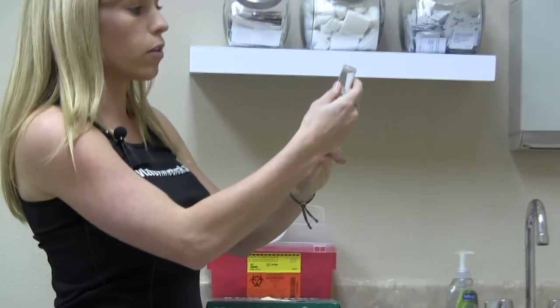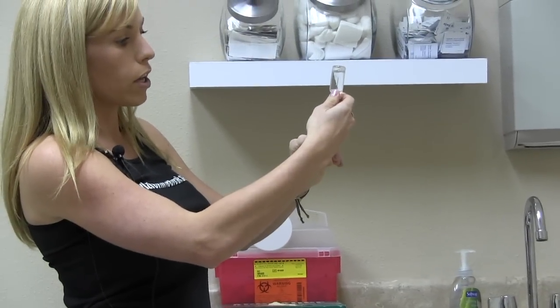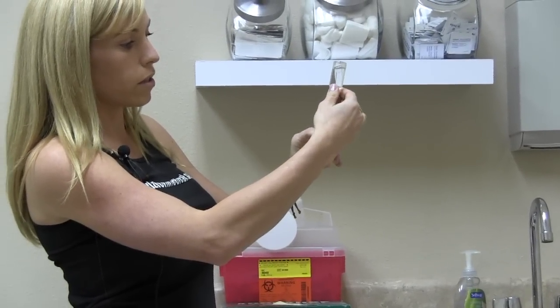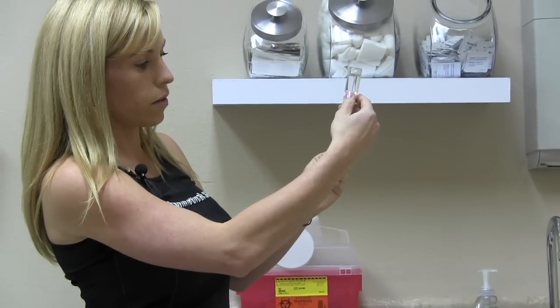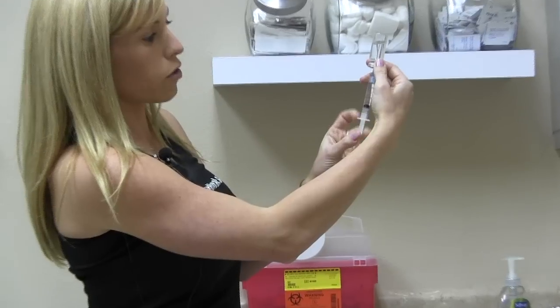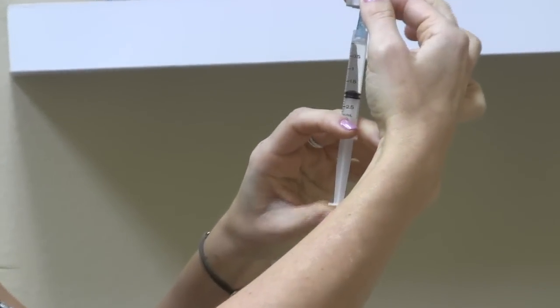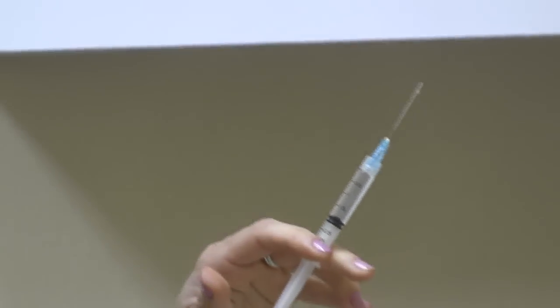Then I want to turn the bottle upside down, make sure that the needle is completely submerged in water, and then withdraw two cc's. You can pull a little bit of extra water in so that we push all the air bubbles out, and then pull the syringe out.